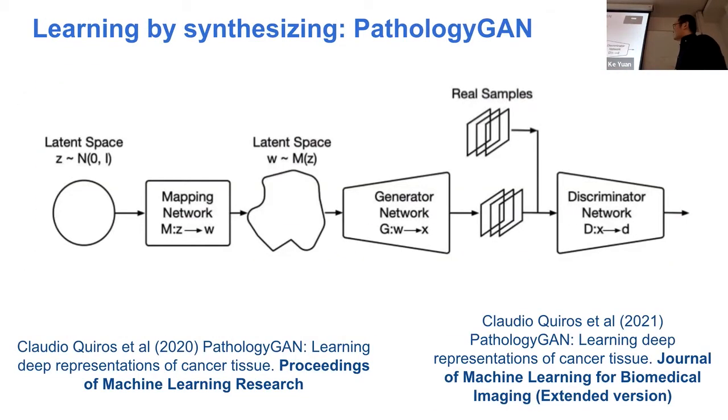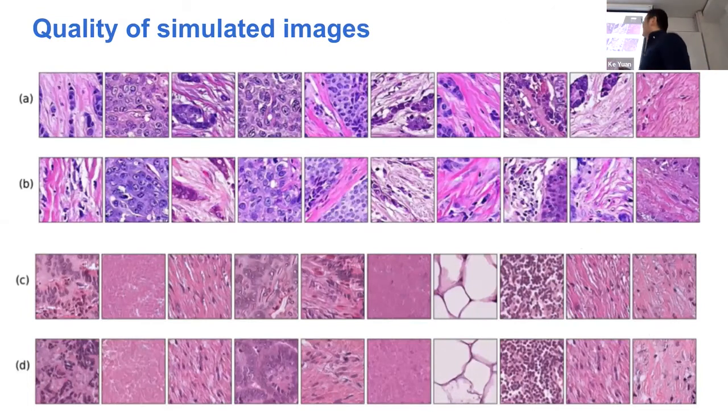The rest of it is relatively standard. We have a technical difference in the loss of the model that we will get to in a few minutes. So here you see the general quality of the image that is generated. Without telling you which one is real and which one is fake, I myself find it very difficult to distinguish real from fake ones. Here you see a model producing images trained on two different cancer types. On top, these are breast cancer images, and at the bottom, these two rows are colorectal cancer images.